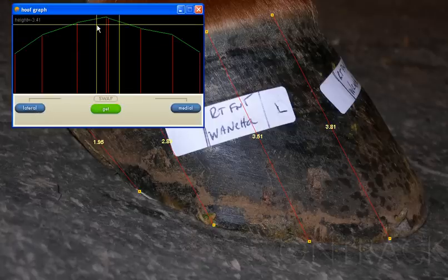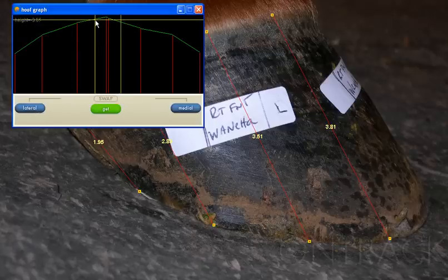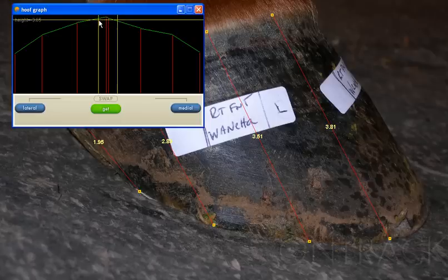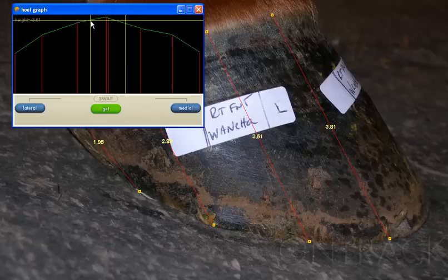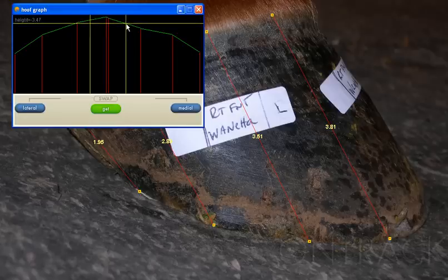As you can see, following this graph, being this is the center mark, equal distance — the yellow line is equal distance away — following my green line down, my medial toe here is either low or my lateral toe is high.